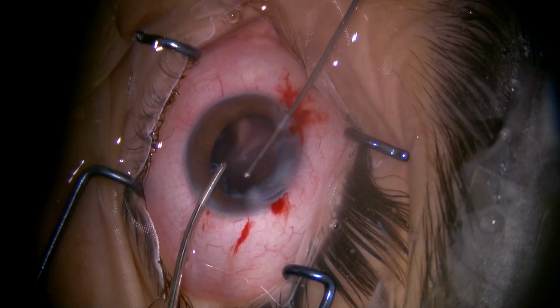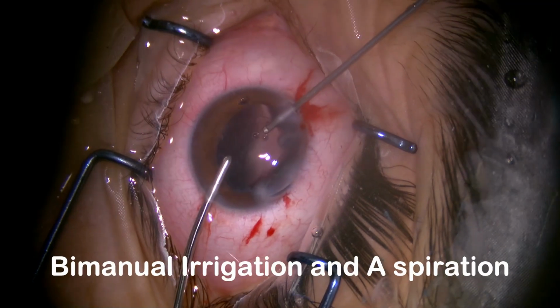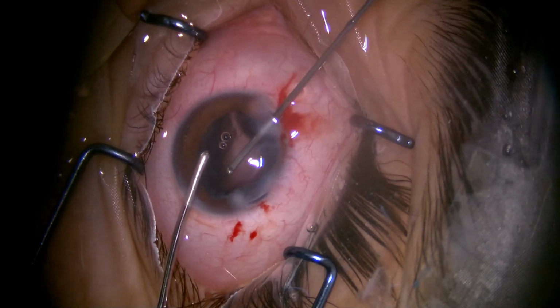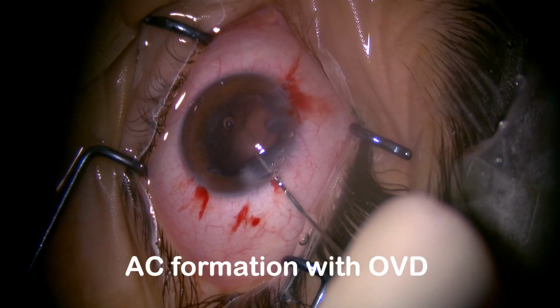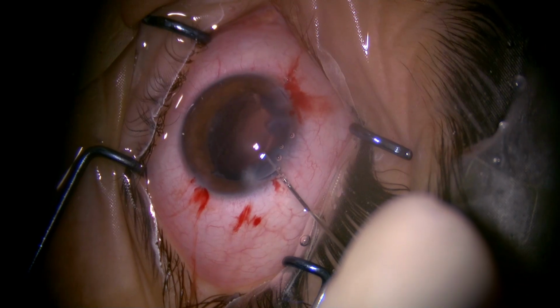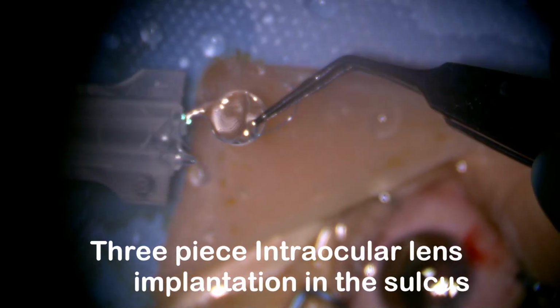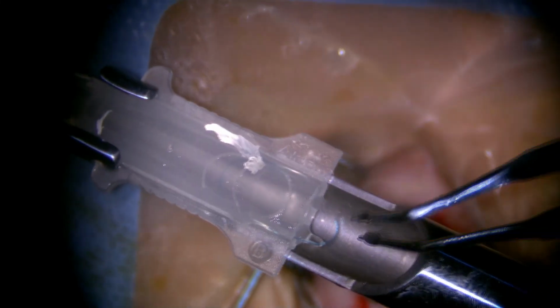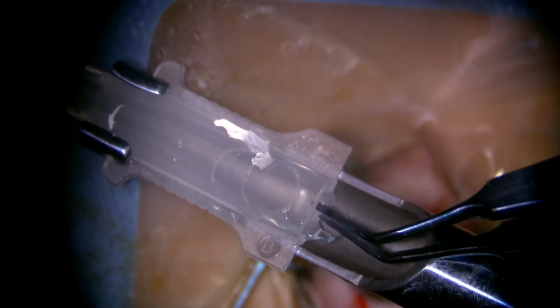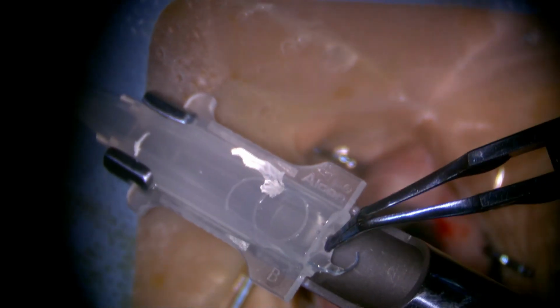It is noted that the irrigation port is upward to prevent hydration of vitreous. Now we can see that the cortical matter as well as the vitreous is being aspirated by the aspiration cannula. Now the viscoelastic substance is being filled in the anterior chamber, and lens implantation is done with a 3-piece intraocular lens, which is specially for such cases of traumatic cataract. The lens is being implanted into the sulcus successfully in the patient's eye.